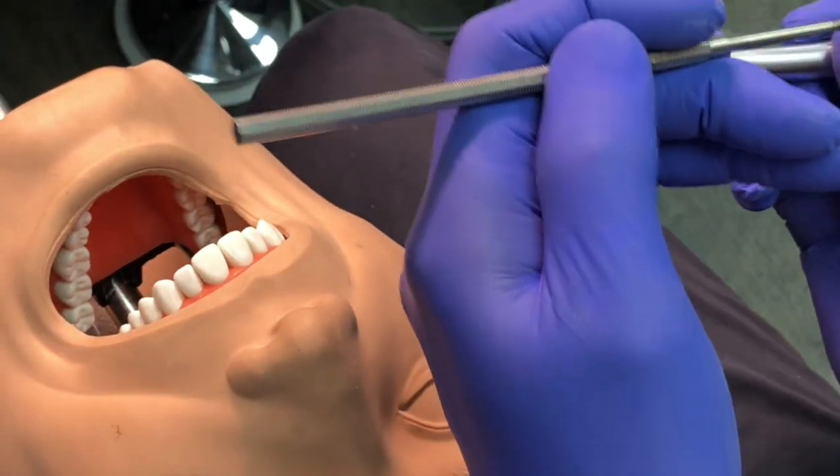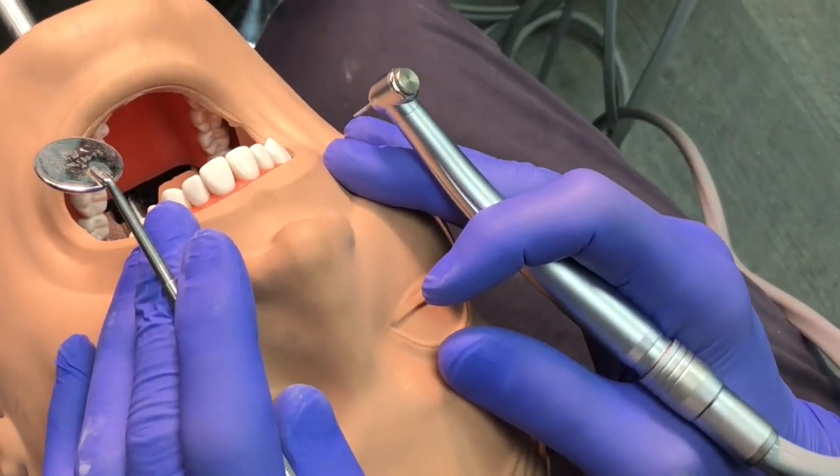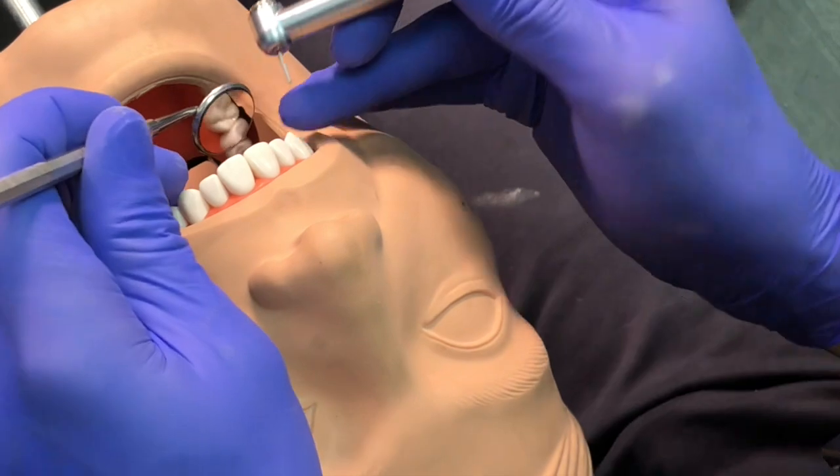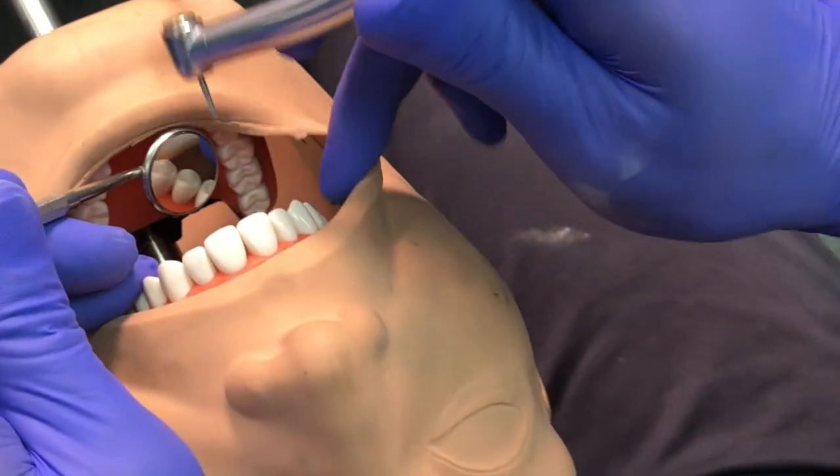It's actually harder to work on the mannequin than it is to work on a patient — it really is. It's a test situation and it's a little intense.